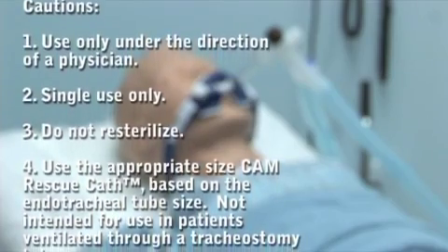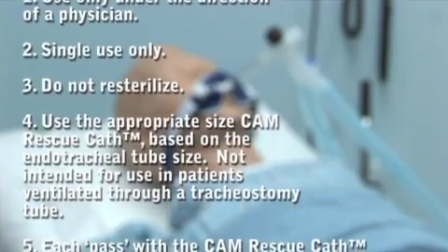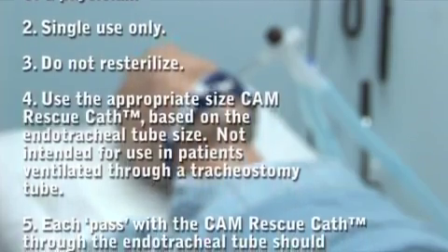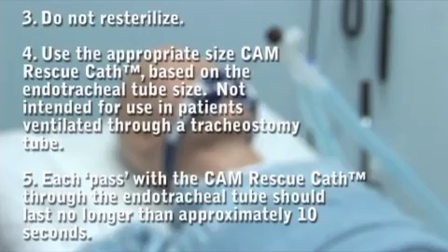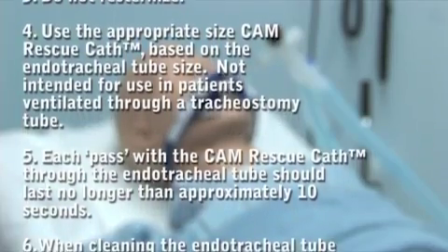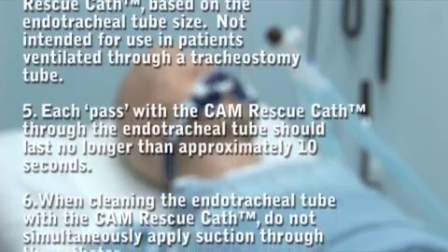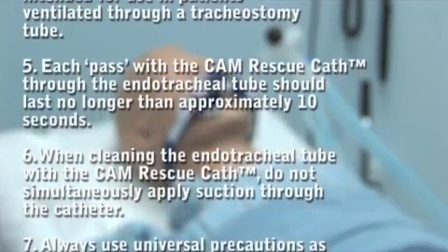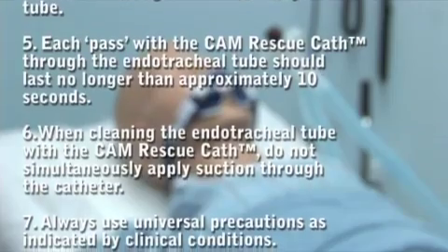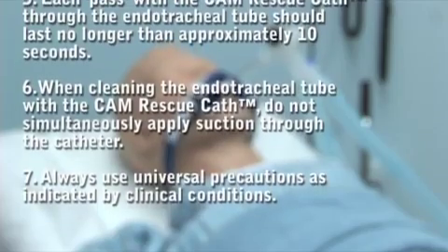Use only under the direction of a physician. This device is single-use only. Do not re-sterilize it. Use the appropriate size CAM Rescue Cath based on the endotracheal tube size. This catheter is not intended for use in patients ventilated through a tracheostomy tube. Each pass with the CAM Rescue Cath through the endotracheal tube should last no longer than approximately 10 seconds. When cleaning the endotracheal tube with the CAM Rescue Cath, do not simultaneously apply suction through the catheter. Always use universal precautions as indicated by clinical conditions.